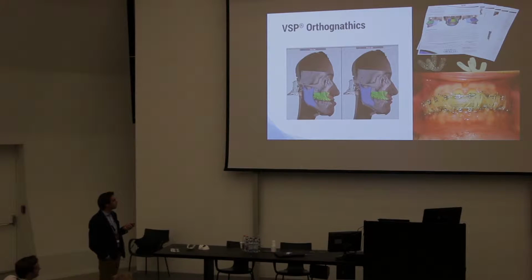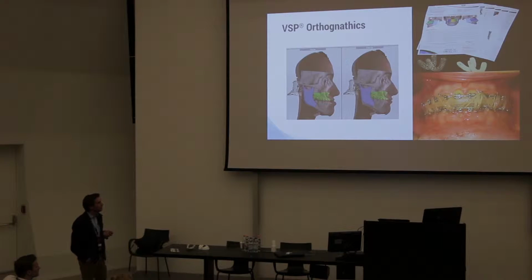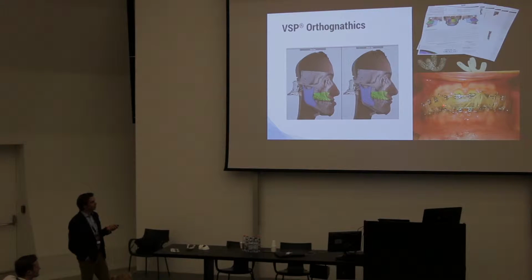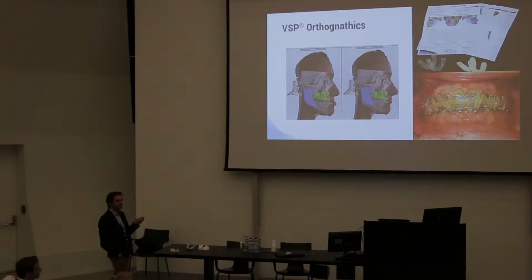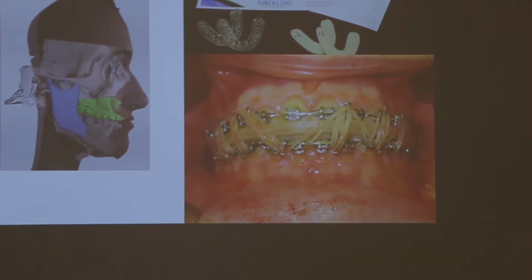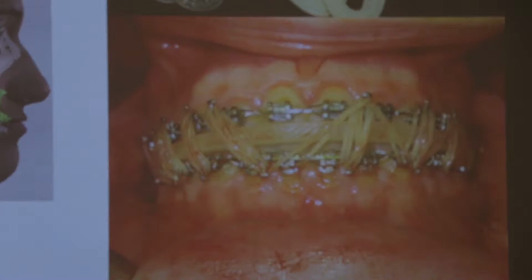And as a result of that procedure, we will get splints that will show the post-operative position between the top and the lower jaw. And actually, the material of the splint is USP class 6 approved, which means that it is allowed to stay in contact with the patient's mouth for 6 weeks, allowing the bone to heal in the correct position as it was planned during the surgery. And then afterwards, the splint can be removed, and the patient will be able to start rehabilitation.